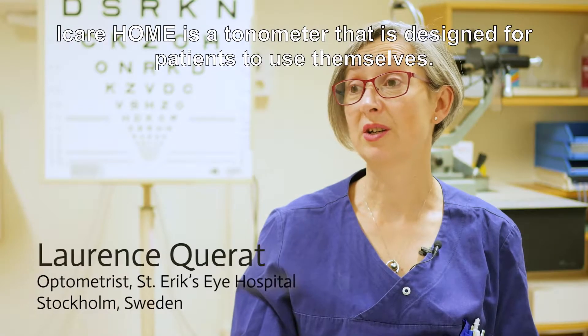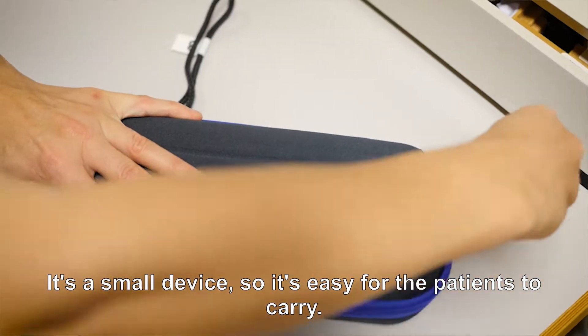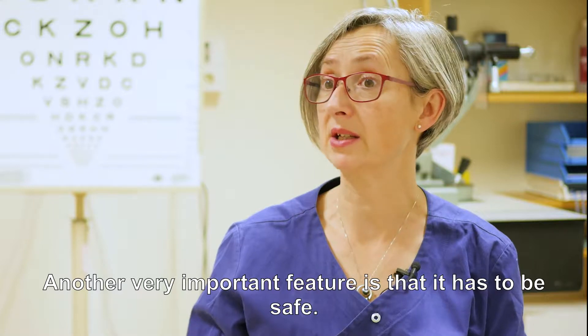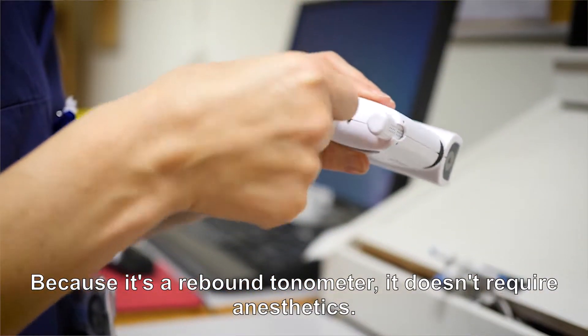iCare Home is a tonometer designed for patients to use themselves. It's a small device, so it's easy for patients to carry. Another feature which is very important: it has to be safe. Because it's a rebound tonometry, it doesn't require anaesthetics.